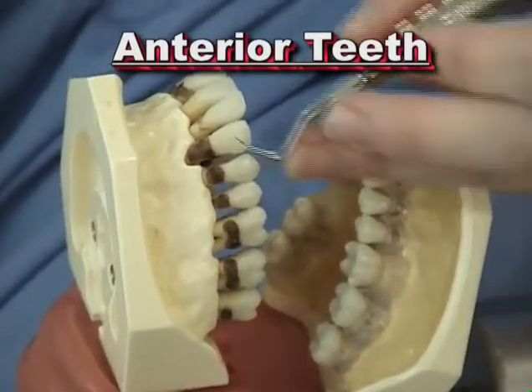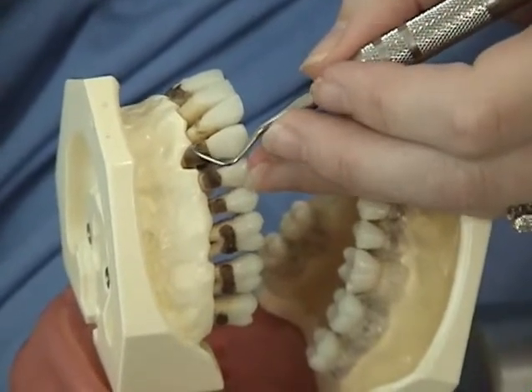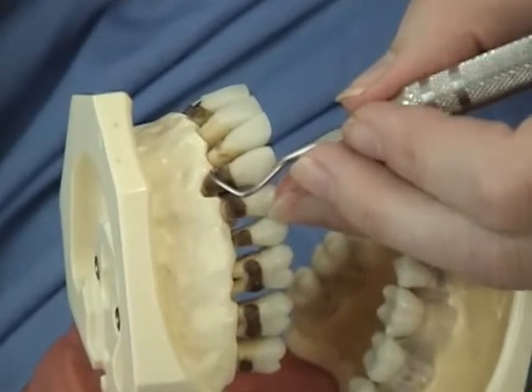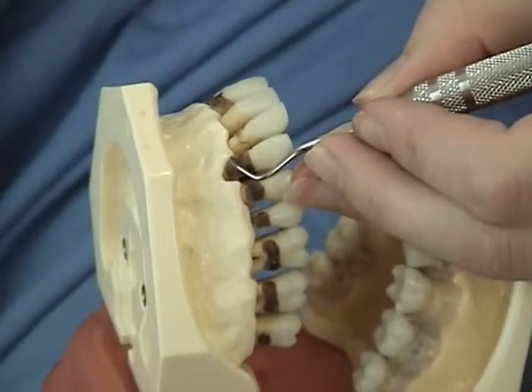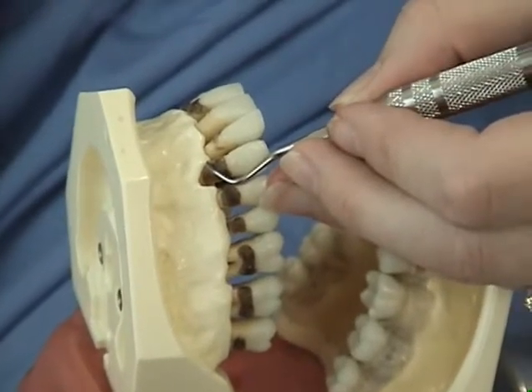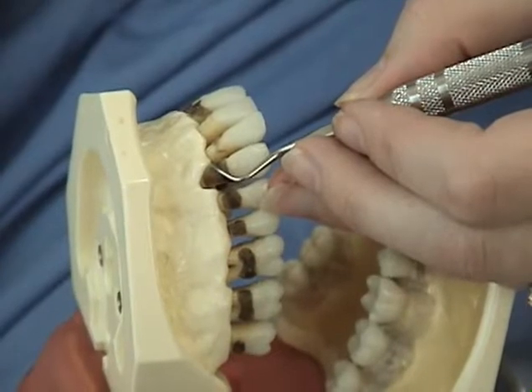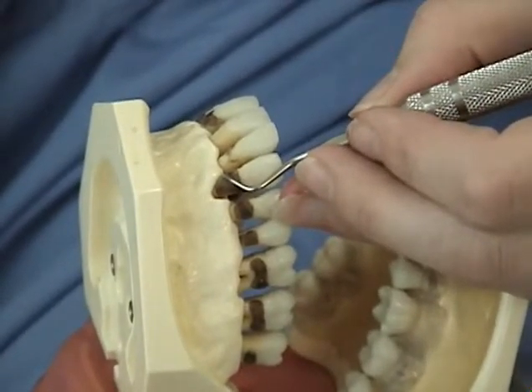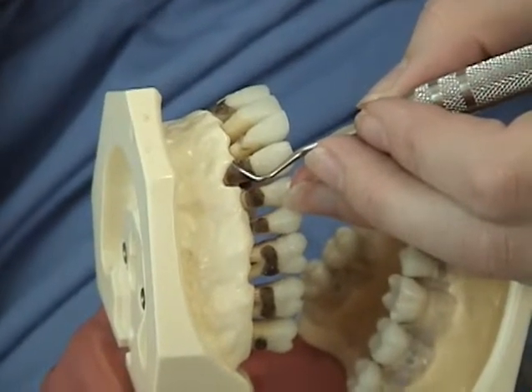When using the universal curette on the anterior sextant, only the outer cutting edges are used. The face of the working end should tilt toward the tooth surface, and the lower shank reaches across the tooth surface. A visual clue is that the handle of the 3-4 universal curette is parallel to the long axis of the tooth. This is the correct cutting edge.